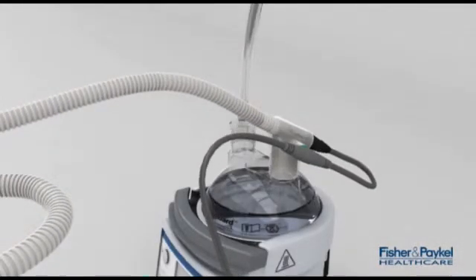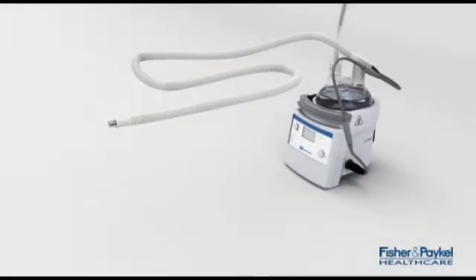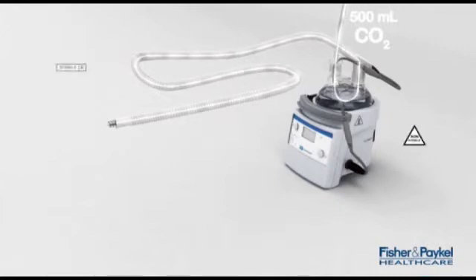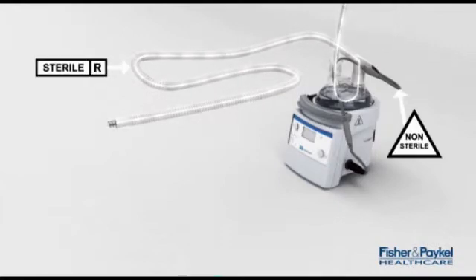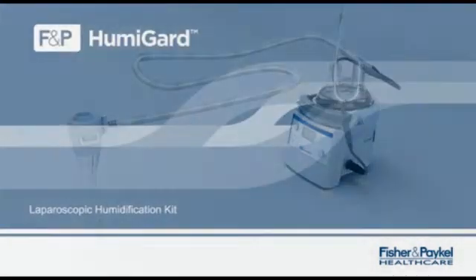Once the electrical adapter is fully connected, the green light above the on/off button will become solid, indicating the Humiguard system is on. Push the elbow into the chamber and follow usual instructions to turn on and set the gas flow. The Humiguard system is now fully operational, delivering 37 degrees and 100% relative humidity right to the patient.